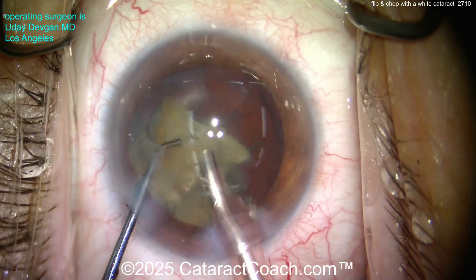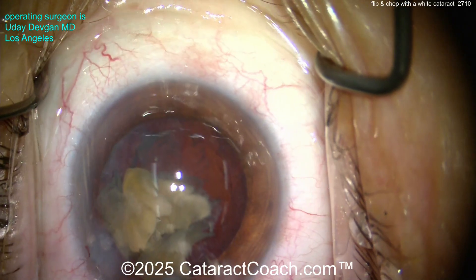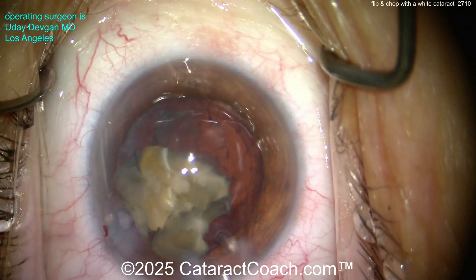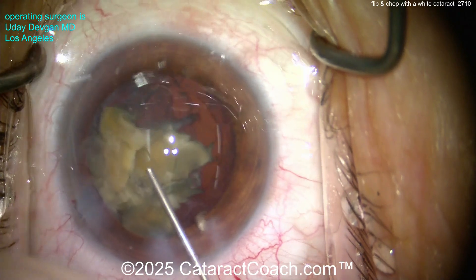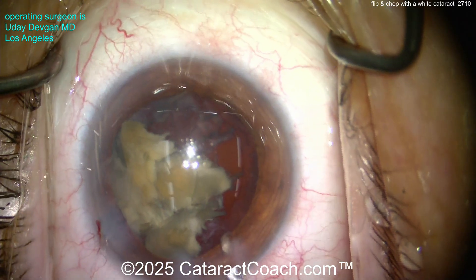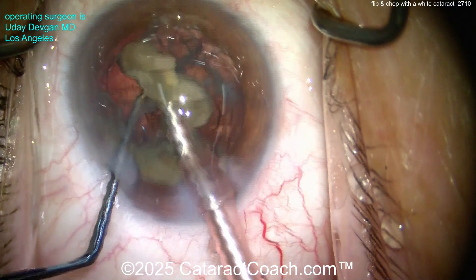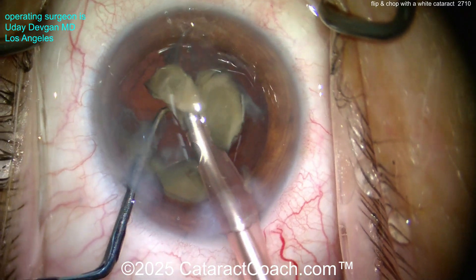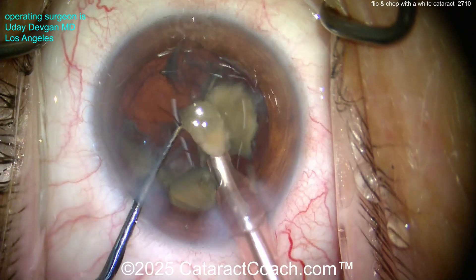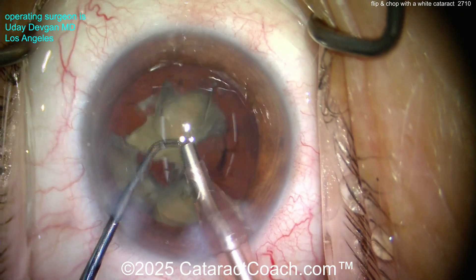Now keep an eye on the total amount of energy put in the eye — maybe it's time to recoat the endothelial cells. You've got a remaining endonucleus in the bag; we've got to recoat the endothelial cells. More dispersive viscoelastic is going to protect the corneal endothelium, making sure those cells are nice and happy so you get a clear cornea on post-op day one. Now we've recoated the endothelium and we're operating underneath that protection of viscoelastic, slowly emulsifying these pieces.